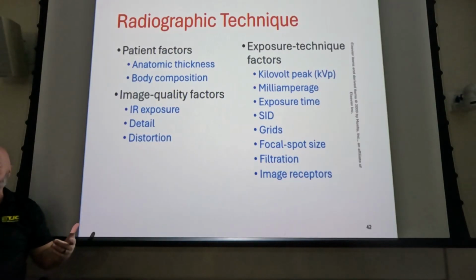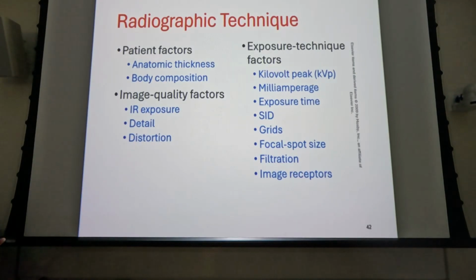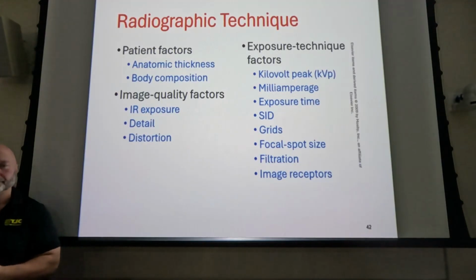Somebody said that we still have a clinical site that has CR capabilities. Is any clinical site using CR, because you have to switch out the image receptor? We have a portable, but they don't really use it. They don't use it? Yeah. I think Cedar Creek has a portable too, but we don't use it. I think all their machines are CR turned into DR. Yeah, they just upgraded, they didn't get anything new. They just added a DR cassette, yeah.